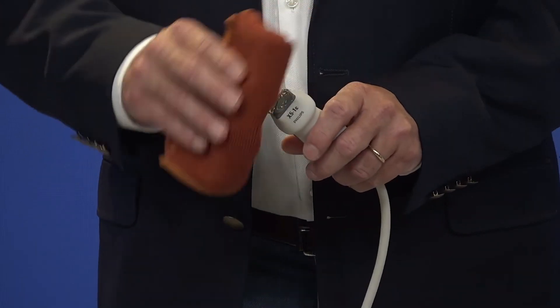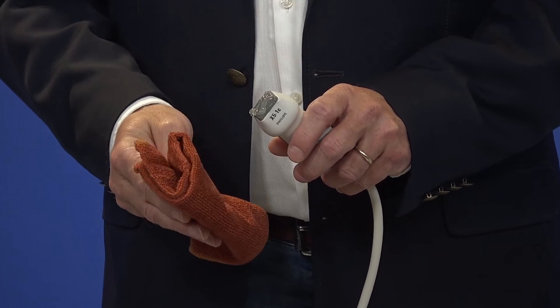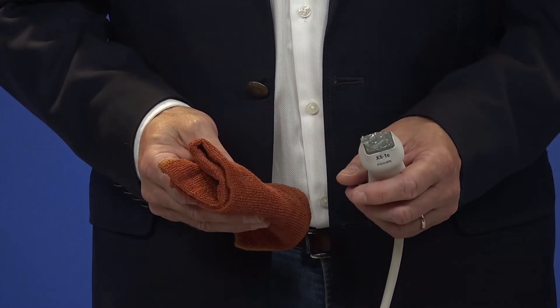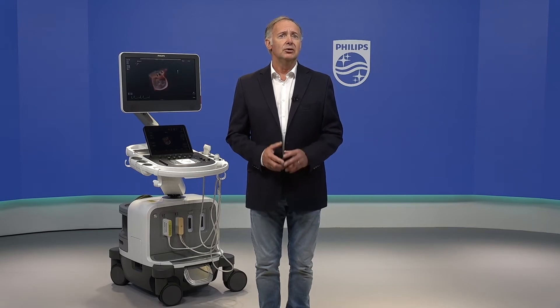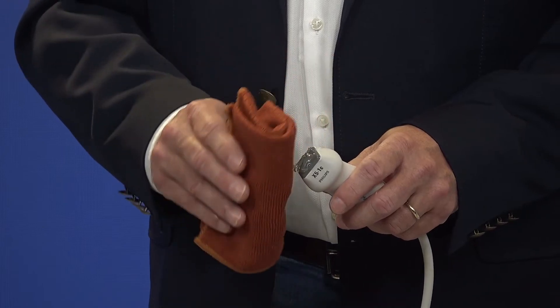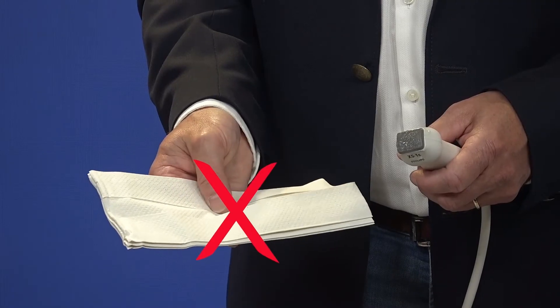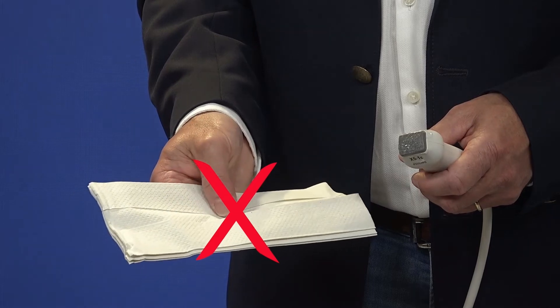When you are finished with your exam, use a soft moist or damp cloth which is lint-free and non-abrasive to carefully wipe off the remaining gel from the contact surface and housing of the transducer. When cleaning the contact surface, do not twist the transducer but wipe the gel off parallel to the contact surface. Do not use any paper or other material with a rough surface because they can cause damage to the contact surface or lens of the transducer.